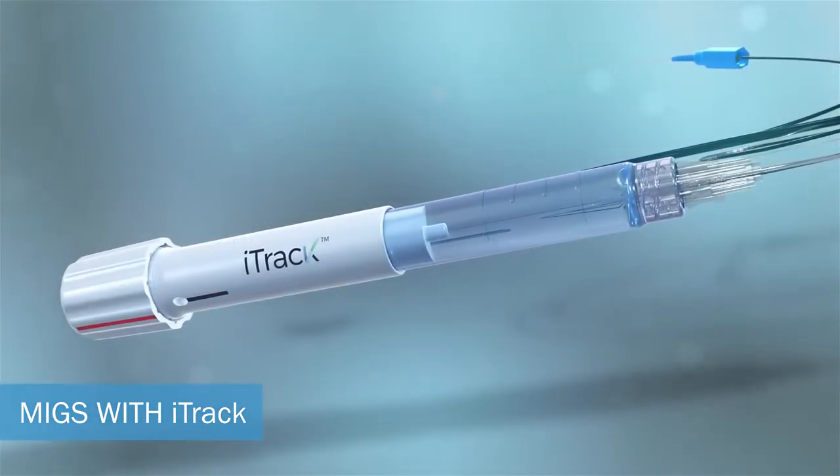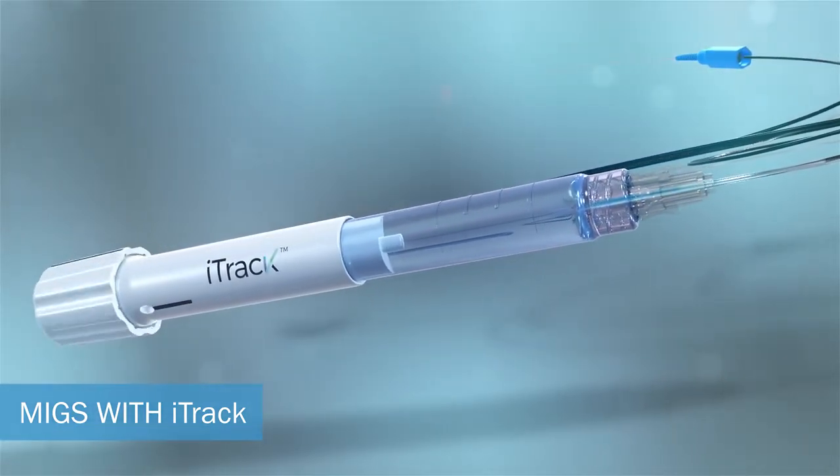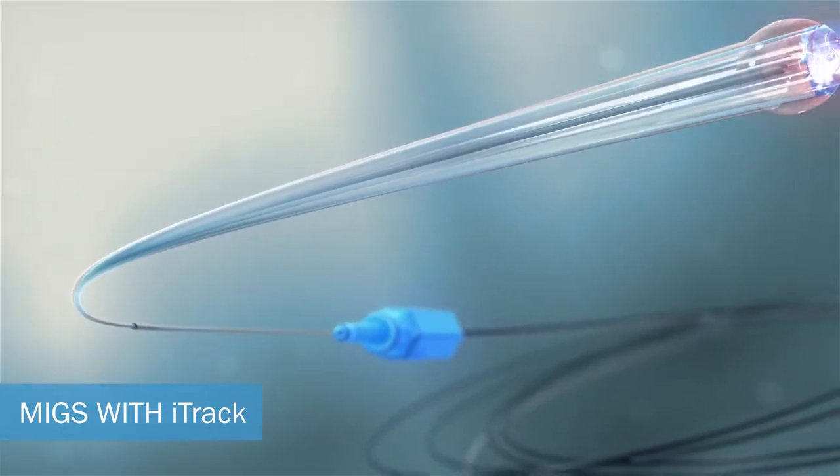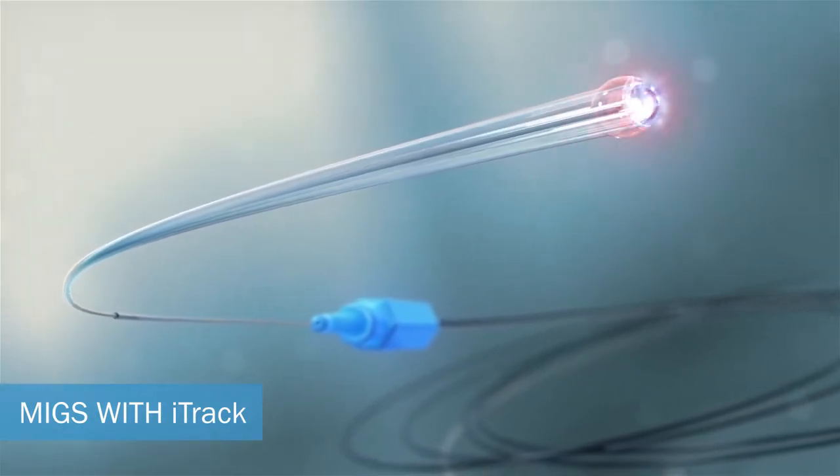Before commencing treatment, prime the EyeTrack with high molecular weight viscoelastic. Once fully primed, viscoelastic will ooze from its tip.